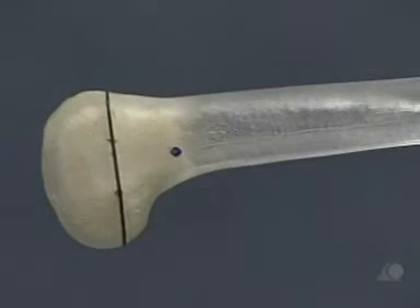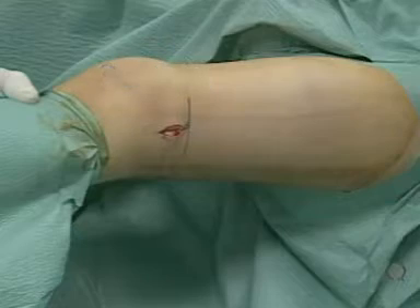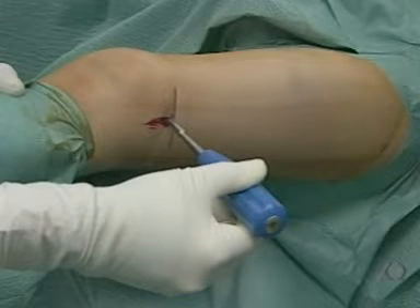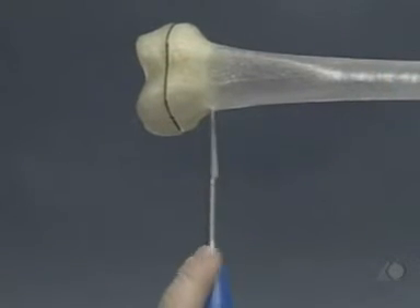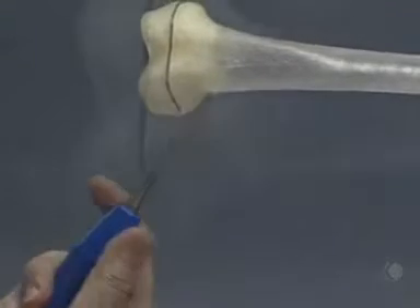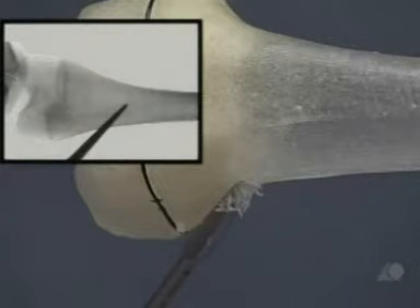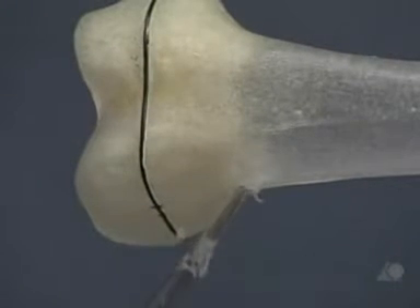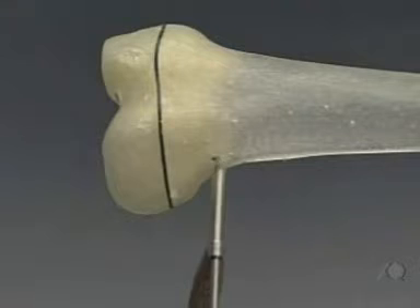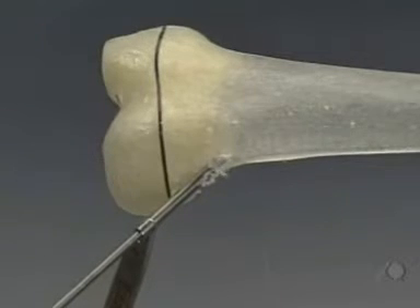The skin incisions are made at the planned insertion points, running distally for 3 to 4 cm depending on the size of the child. At the proximal end of the incision, the awl is inserted vertically down to the bone in the midline of the femoral axis. With rotating movements, a center mark is made, then the awl is lowered to 45 degrees in relation to the shaft axis and the perforation is continued at an upward angle. The position and depth of the awl are checked under the image intensifier. Alternatively, the medullary cavity can be opened with the appropriate drill bit and drill guide; the drill bit may be lowered to 45 degrees only when the drill is running, otherwise the tip could break.